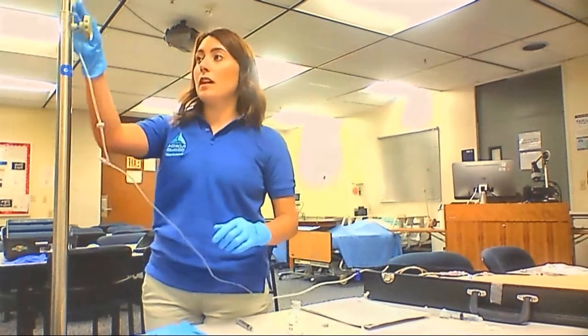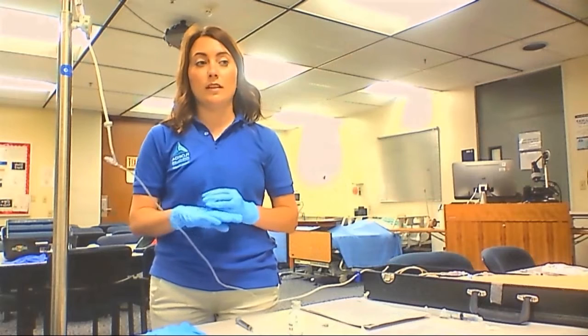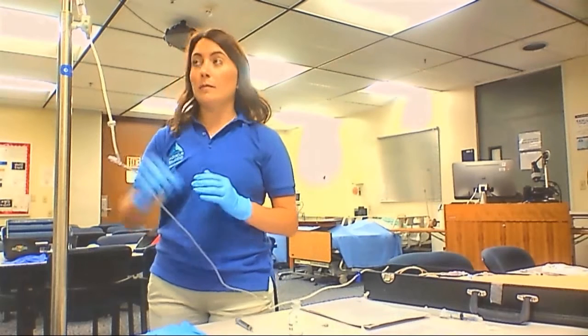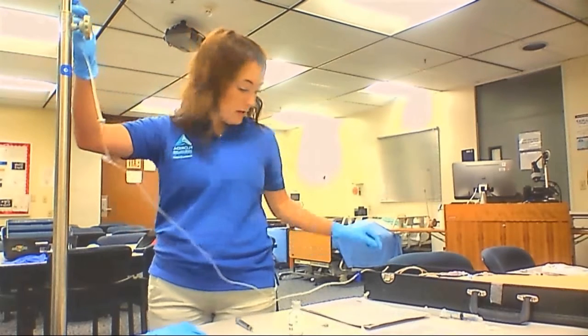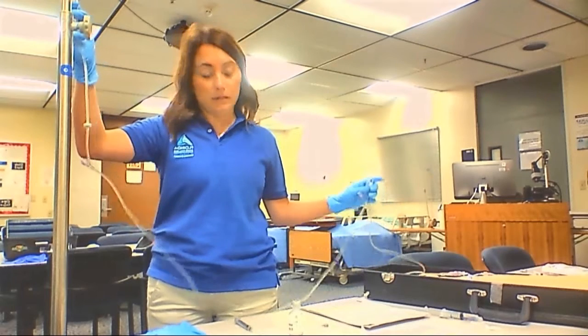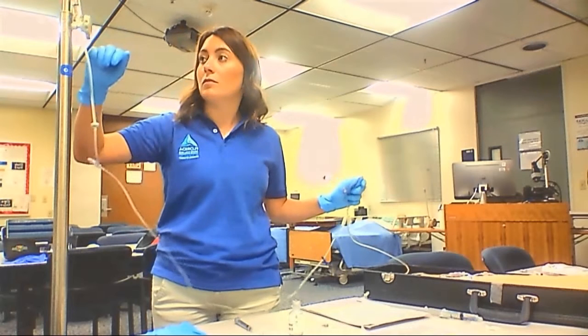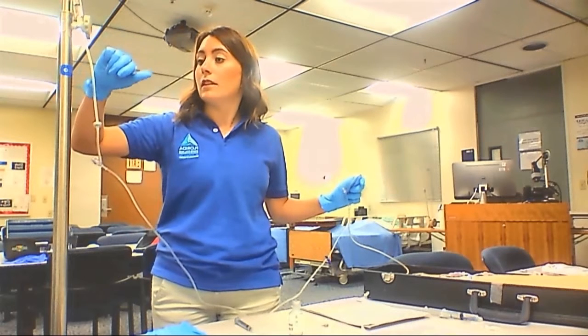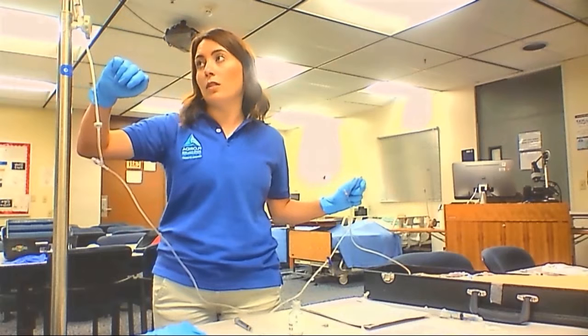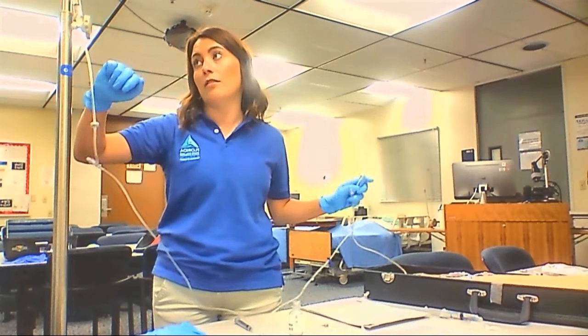And then I want to just go ahead and make sure that I calculate how many drops per minute that the patient's going to be receiving. So it's going to be 17 drops per minute, which I will observe here in the IV using the clamp method. So I'm going to clamp and unclamp. And I'm just going to continue to observe for 1 minute, 17 drops per minute, and adjusting accordingly based on how fast or how slow that the drops are coming out of the saline bag.